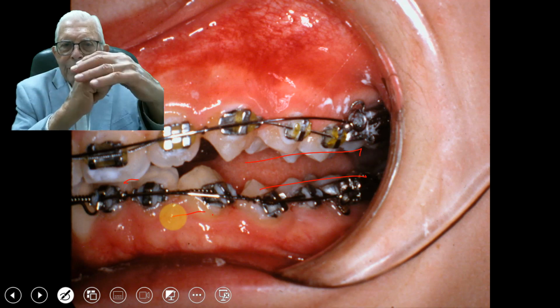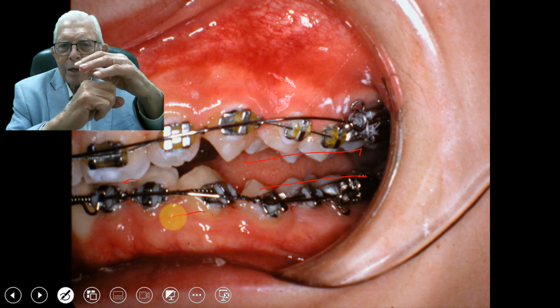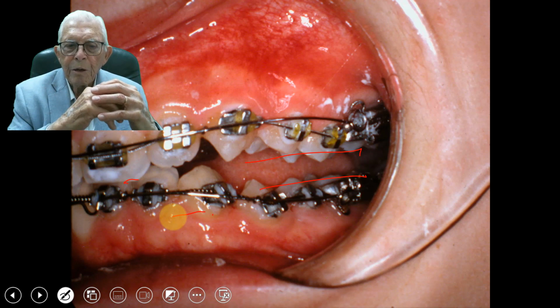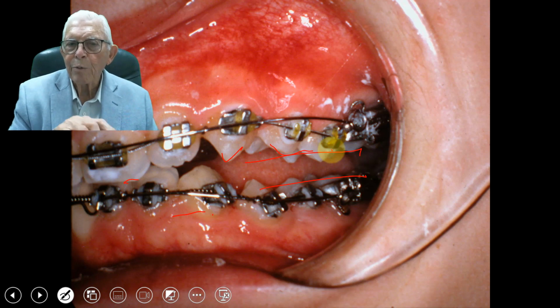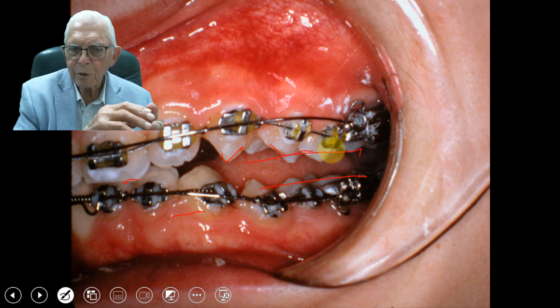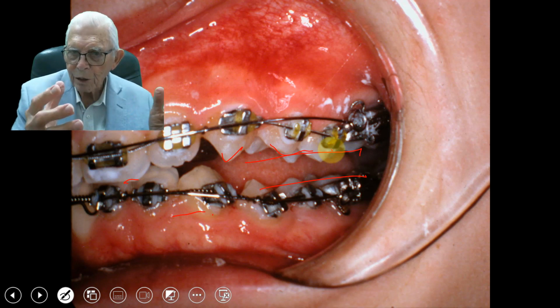And it's in the fossa. As you lean it back, it moves the jaw forward. And you hold it there long enough and it'll grow in that position. And if you have cusps on the teeth and lock it in position, it's kind of like a Herbst appliance. Won't work on the deciduous teeth because they don't have deep enough cusps, but when you get into permanent teeth like that and get them locked in that position where the person uses them there, then it does work.